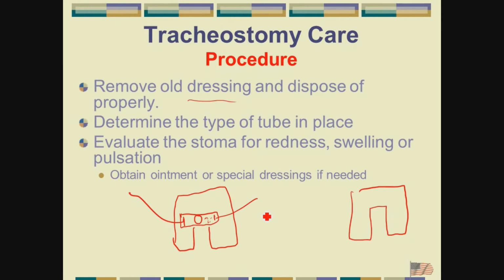What would you do if you did feel the pulsation? Holy moly, I would call my doc right away and say, I'm feeling a pulse on this trach when I'm doing my dressing change here. And overinflate that balloon too. Yep. Call the doc first, and then overinflate or put some pressure on the front of the neck, especially if you see any kind of oozing blood or anything. That's just the scary one. Is the ointment automatically ordered when somebody has a trach? Yeah, it's just kind of a standard part of the process.